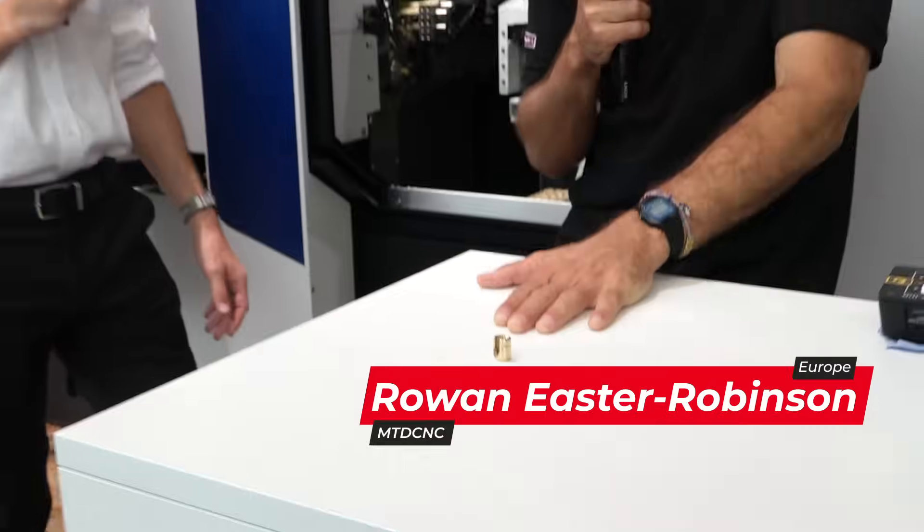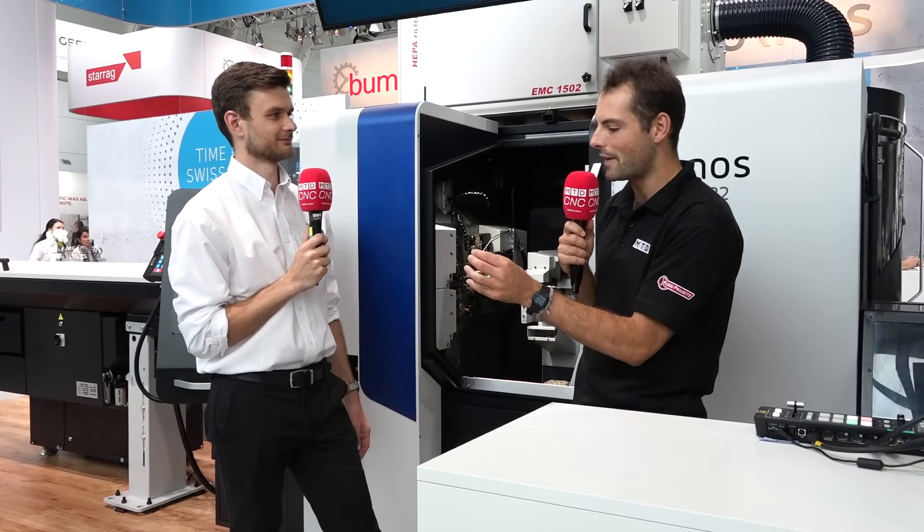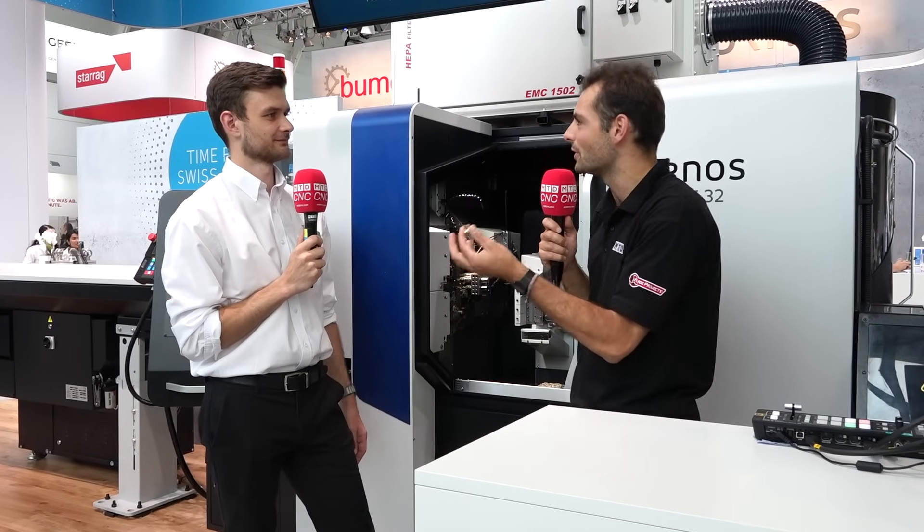Wow, look at this medical component. We're here on the Tornos stand at AMB 2024. Oliver, before we talk about the machine that made it and the fascinating demo you've got, what is the component and what challenges do manufacturers face making medical components like this?